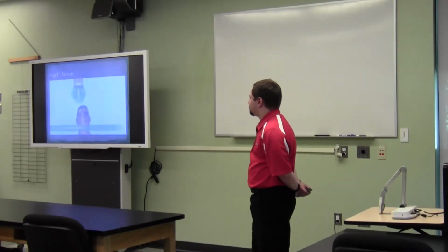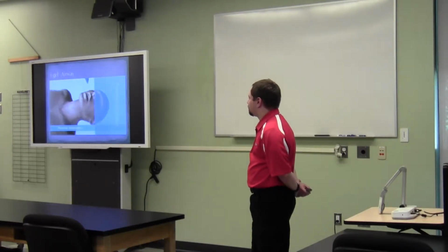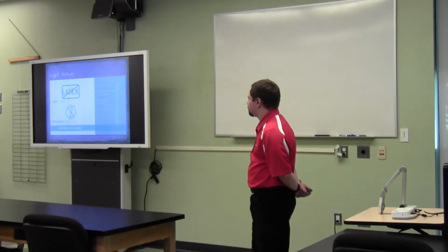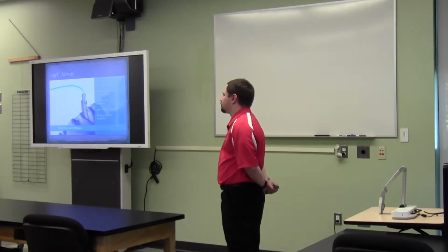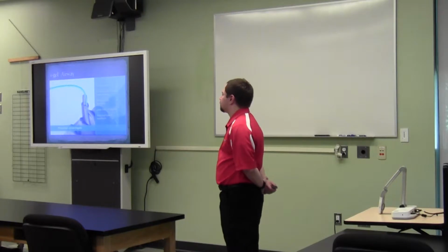A supraglottic airway without an inflatable cuff has several potential advantages, including easier insertion, minimal risk of tissue compression, and stability after insertion. iGel is a latex-free single patient use device that has a gastric channel to reduce the risk of aspiration.